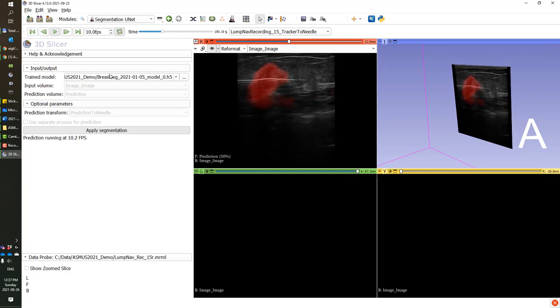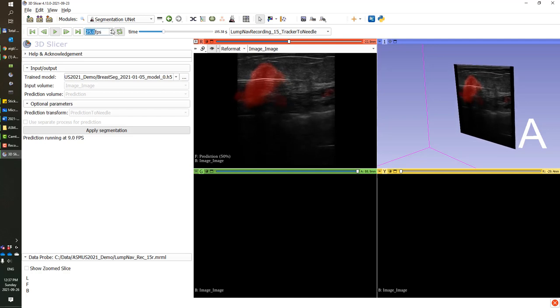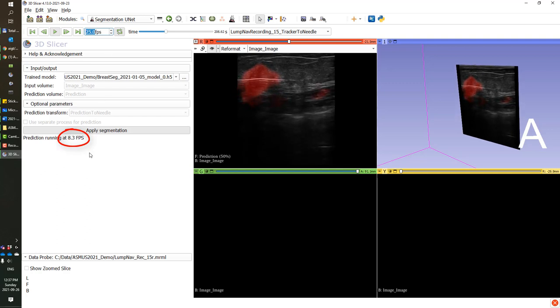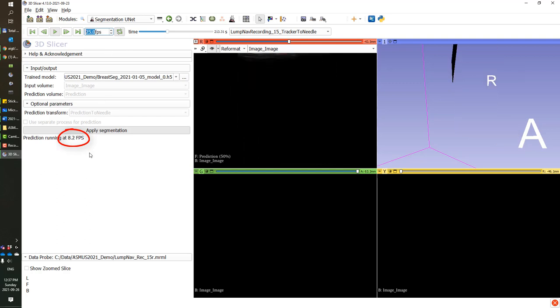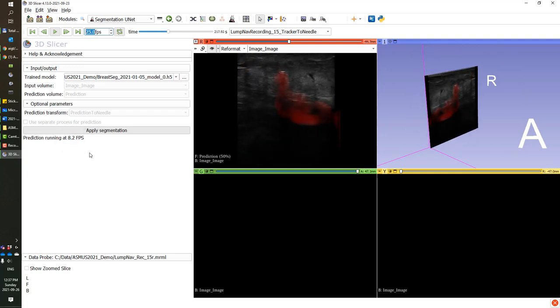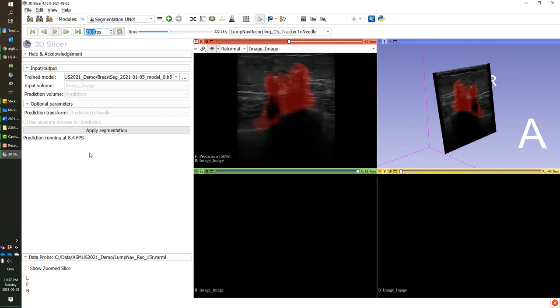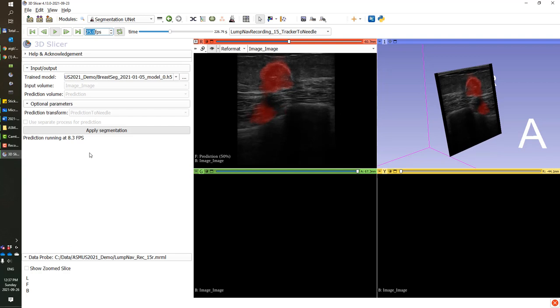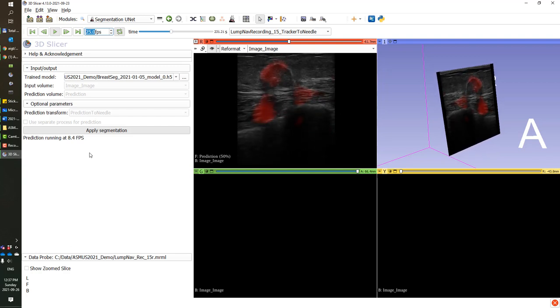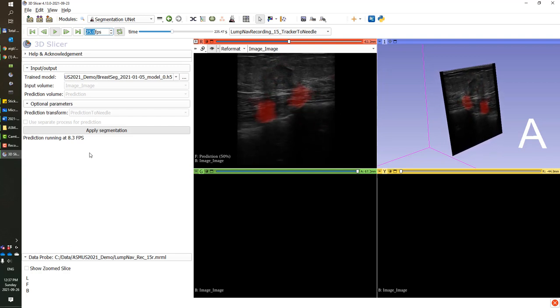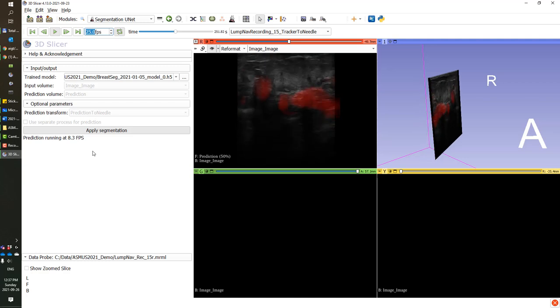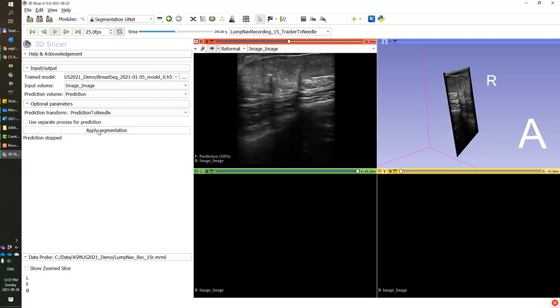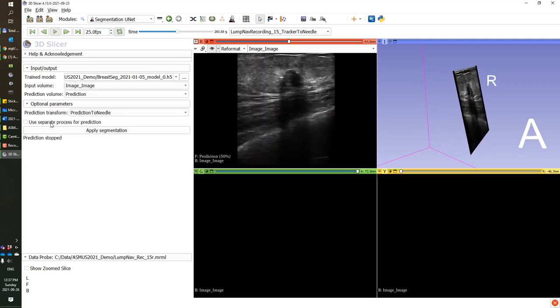As you can see, the FPS value, the frames per second, is quite low. Usually it's under 10 on my computer. Usually ultrasound machines produce over 20 images per second. So if we run the segmentation on the main process, the main Python interpreter of Slicer, then they cannot keep up with the ultrasound machine, which will limit our recording rate and rendering rate on both the 2D and the 3D viewers.